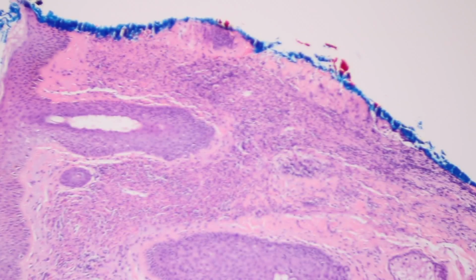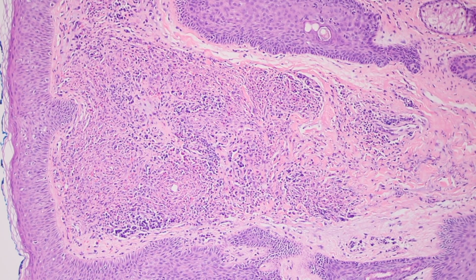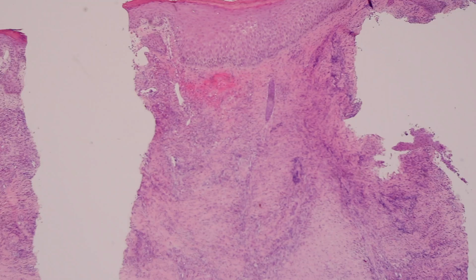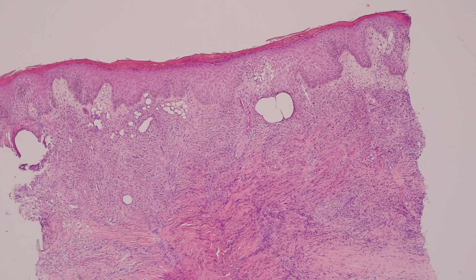And the reason that this is kind of interesting, just to recognize the pattern, but also because there's another entity that has a very similar thing. And in fact, now there are a variety of things that can sometimes have this same pattern. But there's another particular disease in dermpath that has this, and it's called Erythema elevatum diutinum. That's a long name, right? So we call it EED, so we don't have to say that all the time.